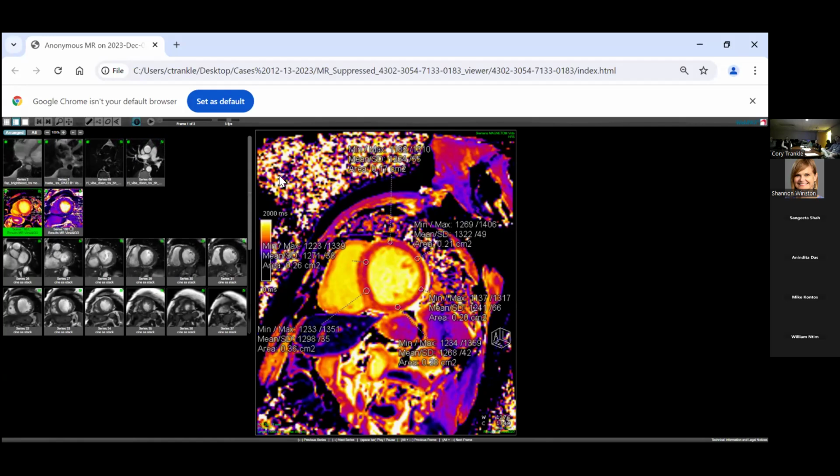Now, when you look at this picture, let's come back to the whole thing. It has some thickness to it. So it has a third dimension. So each of those little squares that you see, if we just talked about them in two dimensions, would be a pixel. But when we add the third dimension, the depth, because of the thickness, then it's called a voxel. Now, this is what's called a T1 map.